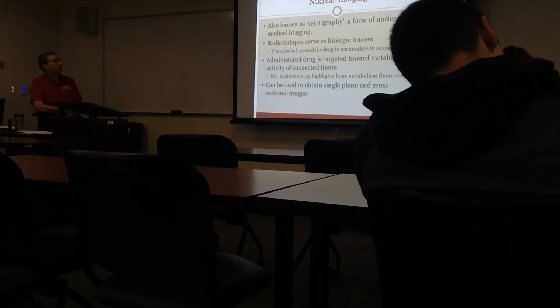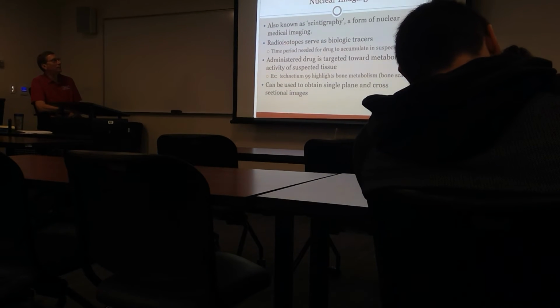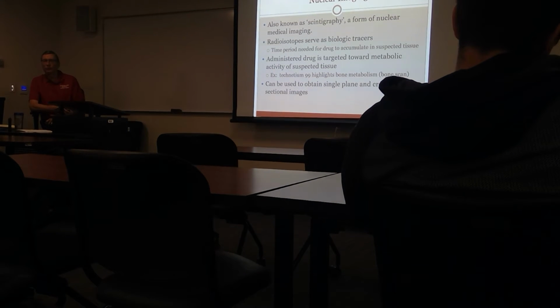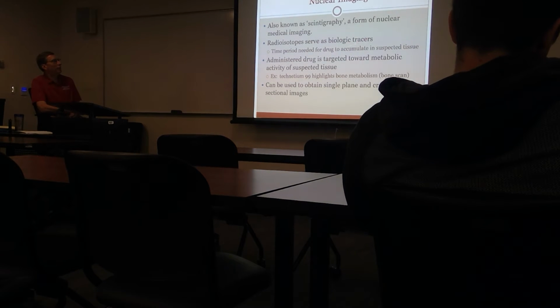Nuclear imaging. In the old days, it was known as scintigraphy. It's a form of nuclear medical imaging. You use radioisotopes. These are the things that get injected into you, and when you go to the bathroom, you pee radioactive stuff for a day or two. It's kind of interesting. But the radioisotopes serve as biologic tracers. So there's a time period needed for these isotopes.